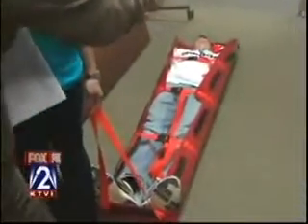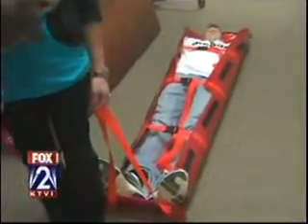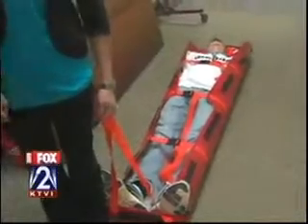You were dragging from the wrong end. I did it wrong. So Kim here is going to drag, what was your name again? Nick, I'm sorry. Now, Nick says he's about 178 pounds. I'm not going to ask you how much you weigh, but she's petite. Let's just put it that way. And let's see if you can drag him.